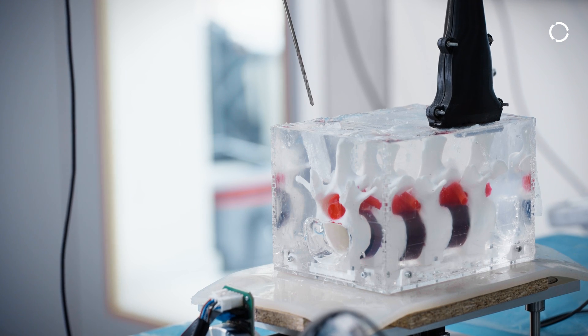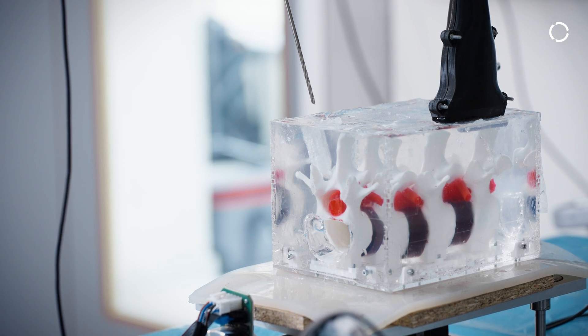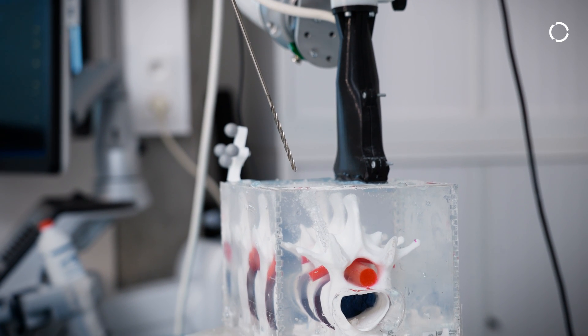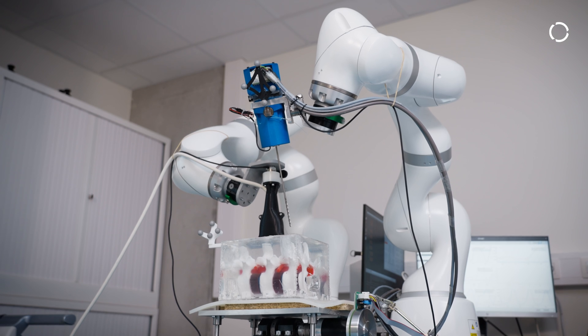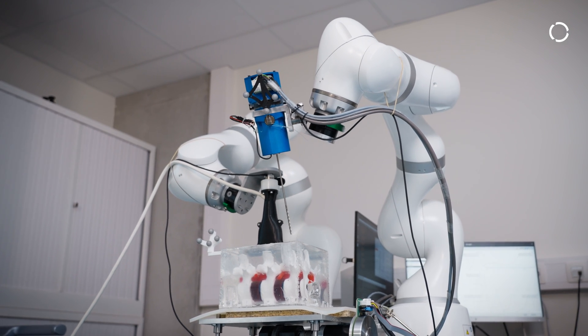We need to drill very precisely. We typically have one millimeter of margin. So if you are drilling on a vertebra and the vertebra is moving one millimeter, you can imagine it's a little bit of a gamble. So by measuring this on the spot, our system is super reactive. It can be faster than the human.